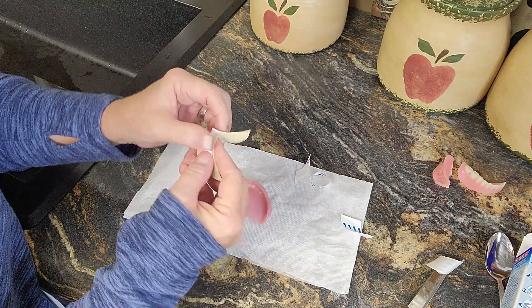Your dentures, your rules — do what works for you the best. Today we're going to try the Secure Waterproof Denture Comfort Strip in my upper denture. I don't have my upper denture in, I have my lower denture in, but we're going to try this strip that says for the lower and the upper and see if it works.